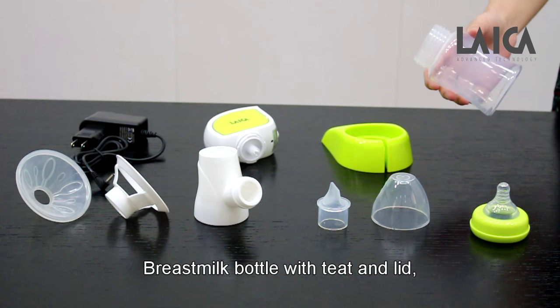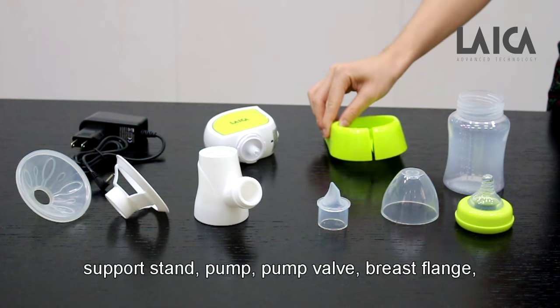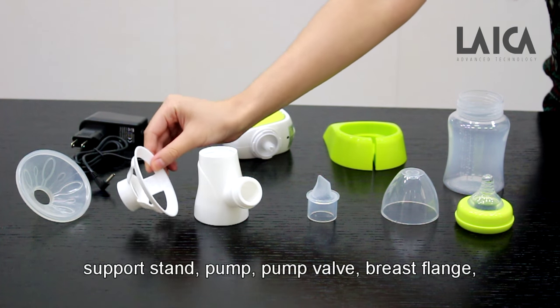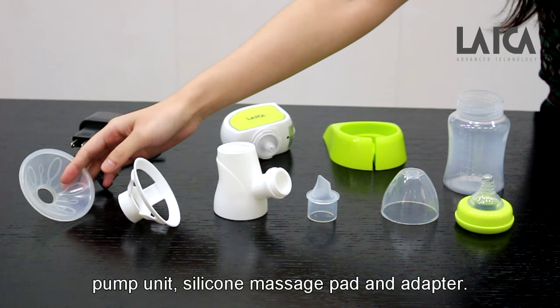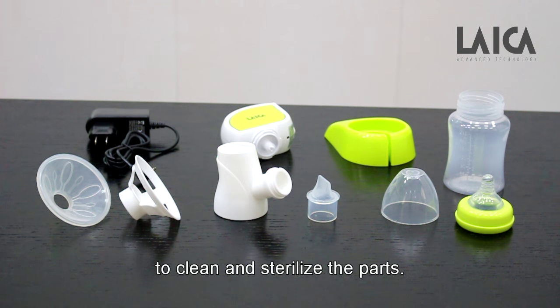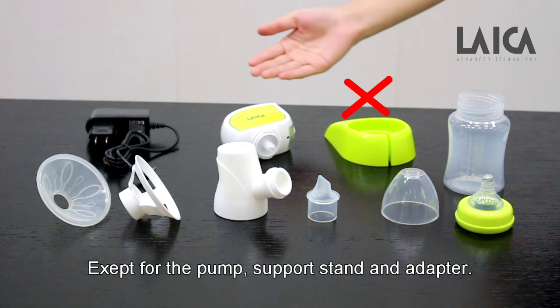Breast milk bottle with teat and lid, support stand, pump valve, breast flange, pump unit, silicone massage pad, and adapter. Before and after each use, it is important to clean and sterilize the parts, except for the pump support stand and adapter.